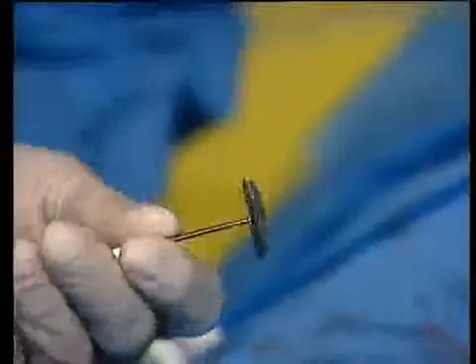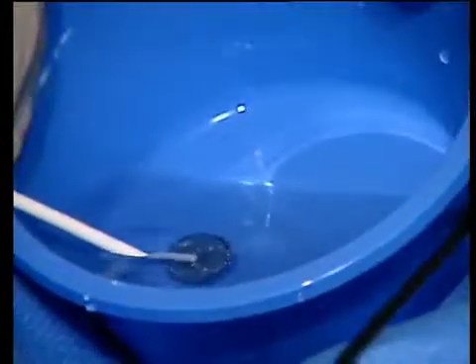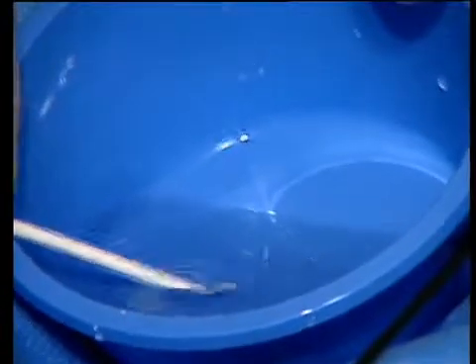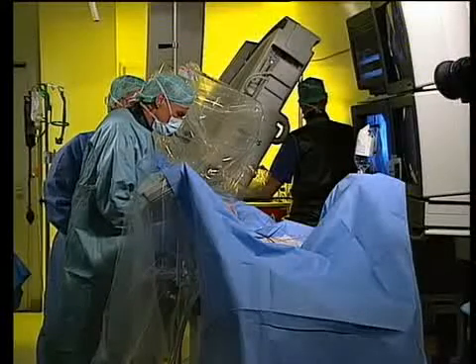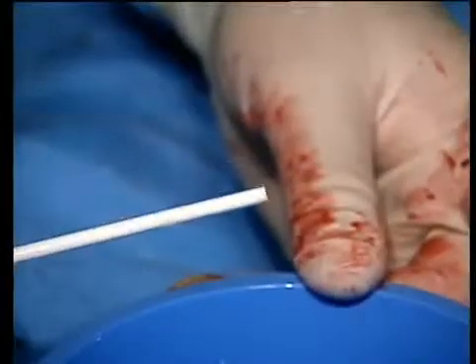What size device is this? This is a 25-millimeter device. We are in a clinical trial right now, and we are supposed to use it in defects which don't extend 10 millimeters. And this defect — any indication of size? It's about 9 millimeters. We measured balloon size, that's 8-point-something.